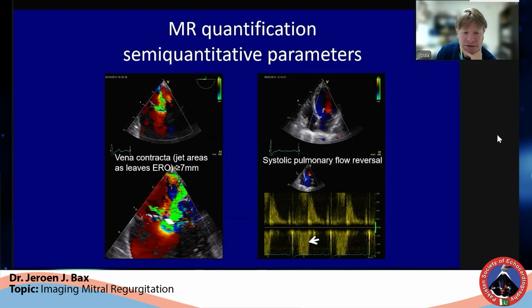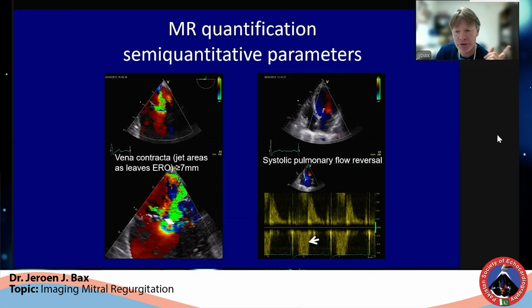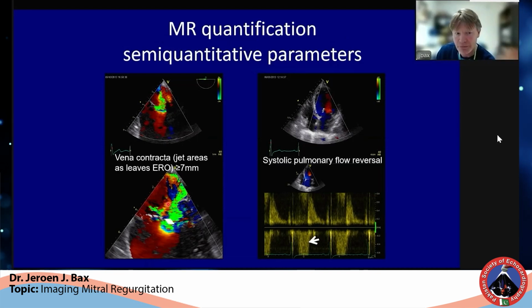This is it. If you measure it and I measure it, we will for sure have two different numbers. I say 7, you say 5. What is important is that the resolution of the echo machine has 5 and 7 but doesn't have 6. So if we start to do academic work and we say this is 6.3, that's nonsense because your resolution simply doesn't allow this. That's why I do not believe much in vena contracta. This comes from the clinical floor, not from studies and research.